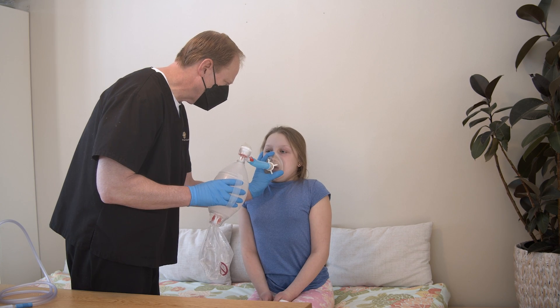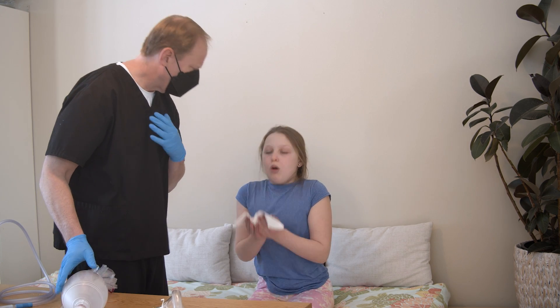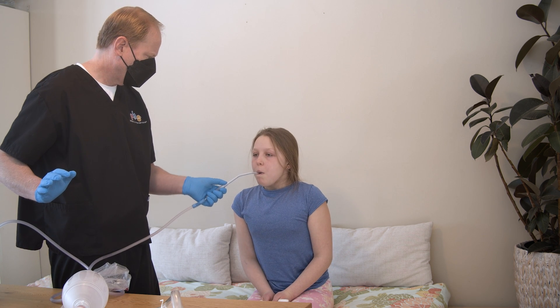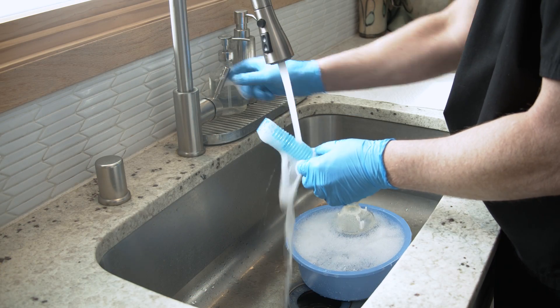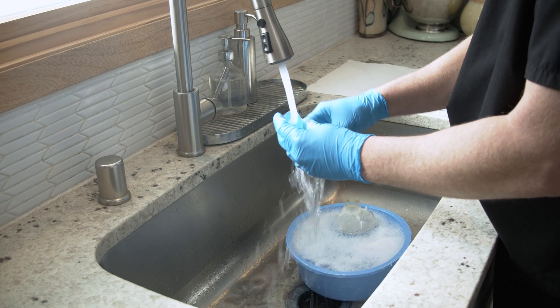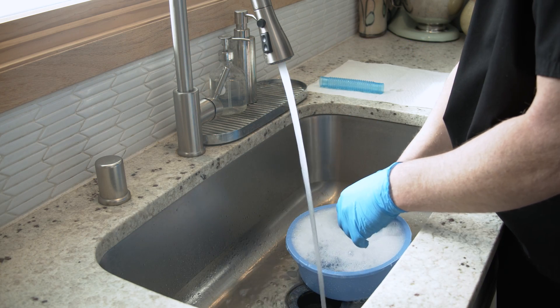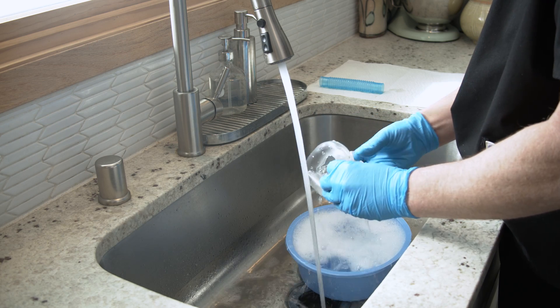When the therapy session is complete, encourage your child to breathe deeply and cough if they can. Use the suction machine to clear secretions from the trach tube or back of the throat if needed. Clean the tubing and supplies regularly to prevent respiratory infection. Refer to instructions from your equipment provider, health care provider, and the product manufacturer to learn how.